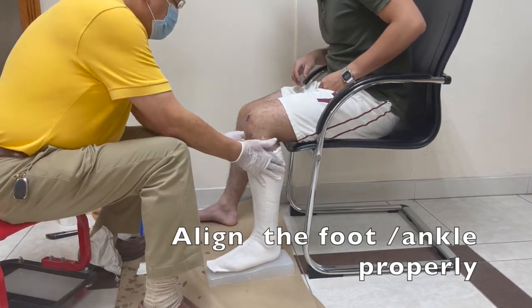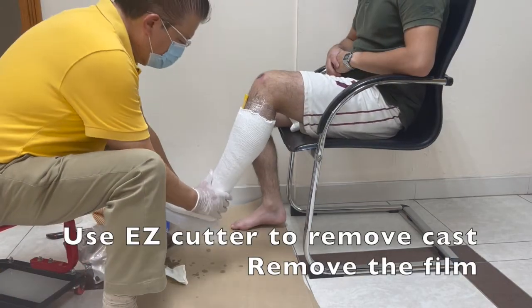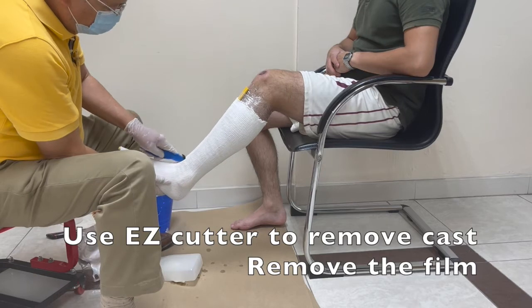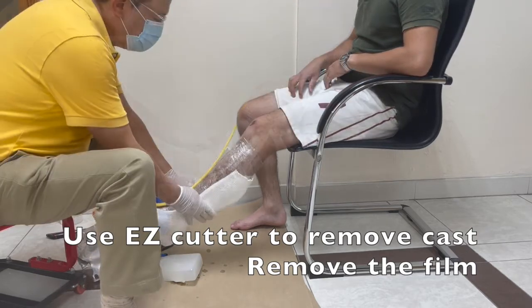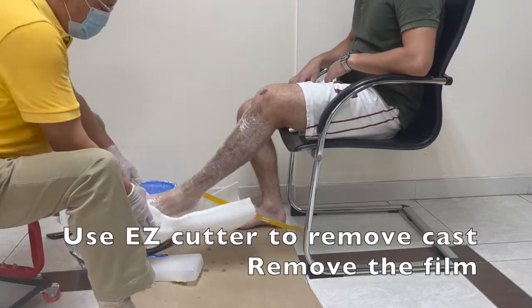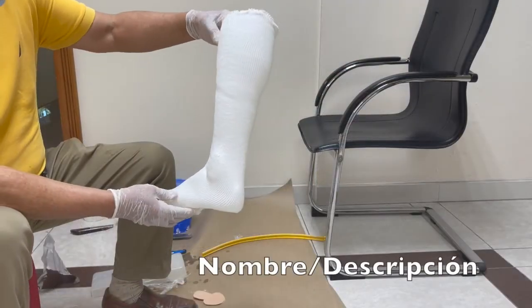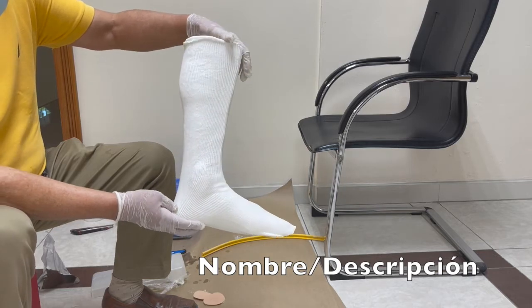You can see here — it's just a matter of waiting, and then we can use the easy cutter to remove the cast. See how easy it is to remove it — you just need to take it off, remove it, and remove the film.